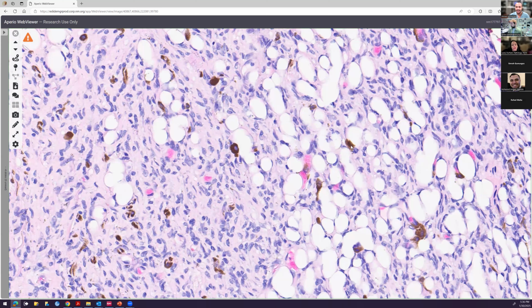Could be melanin. Yeah, it could be. Melanin, it's kind of chunky. Yeah, melanin pigment, exactly. So this is melanin, right? And do you know what this is called? I'd guess pigmented DFSP or melanotic DFSP. It's true. It's called a melanotic, pigmented DFSP. There's a name for it.